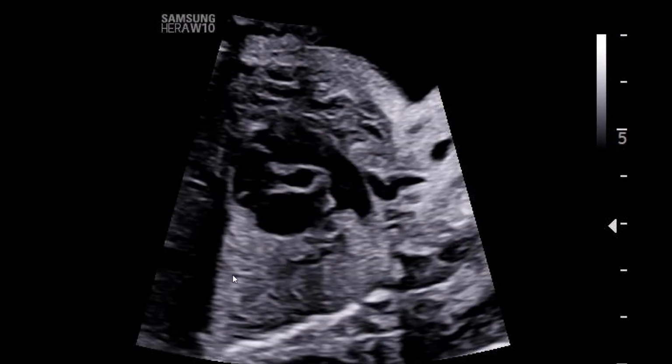Now, from that short axis view at the ventricular level, looking at the ventricular septal defect, ventricular septum and AV valves, we can sweep more cephalad to look at the outflow tracts. Again, this is the RV outflow tract and the main pulmonary artery here. This is the LV outflow tract, subaortic region. Here's that ventricular septal defect, which is more in a perimembranous but posteriorly malinserted, malaligned conal septum.